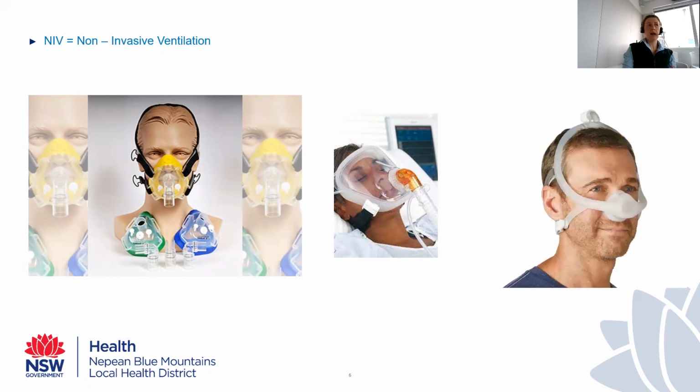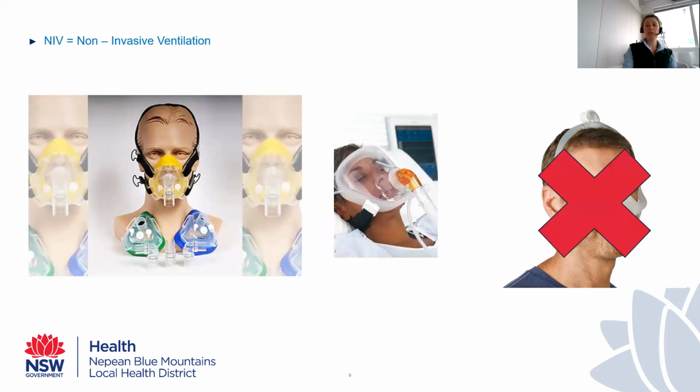Some of you will have seen or be familiar with a nasal mask, and I'm going to go out on a limb here, and there might be some people who want to contradict me, but I'm going to say that in the acute setting, for an acute respiratory failure issue, we do not use nasal masks in the clinical setting. And the reason for that is that we need to provide accurate and consistent pressure levels.